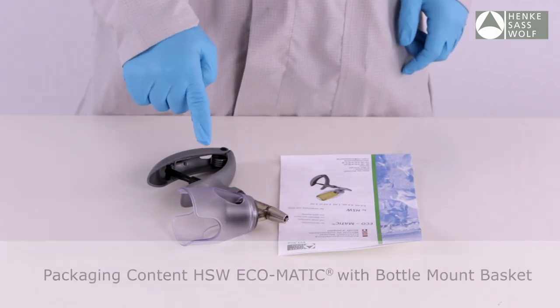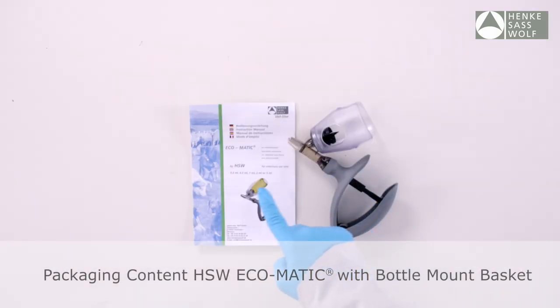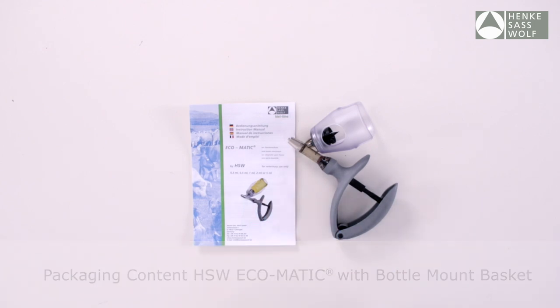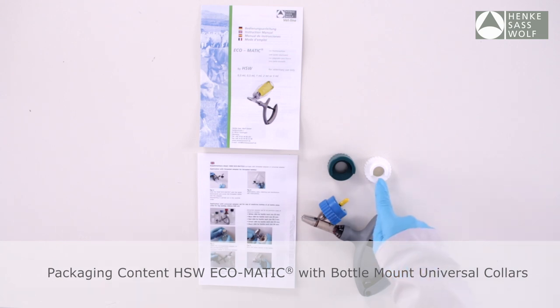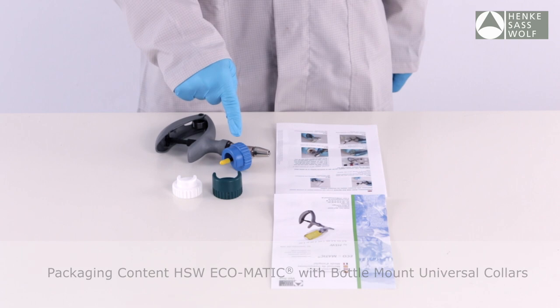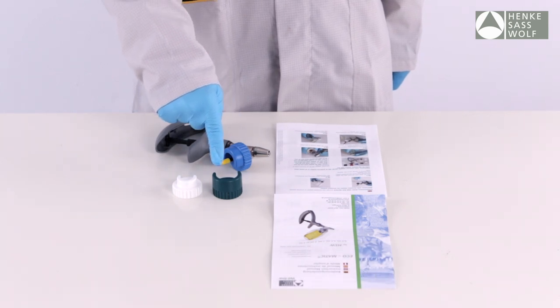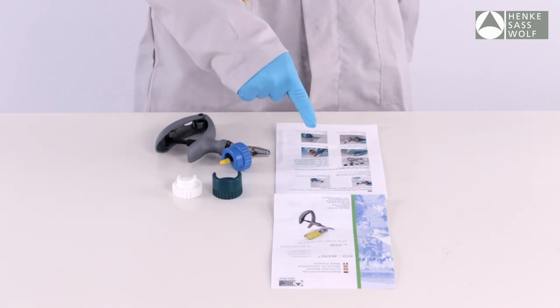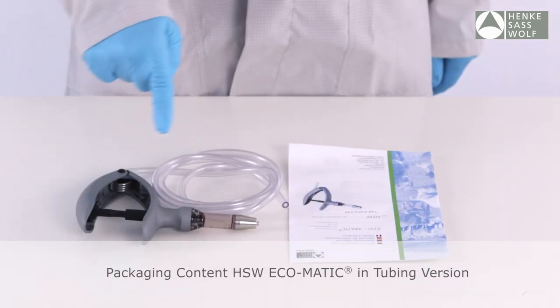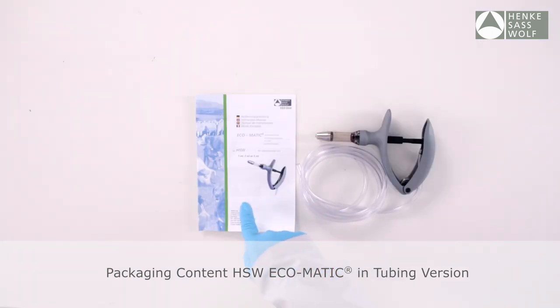Ecomatic with bottle mount. Instructions for use. Ecomatic with bottle mount: white bottle collar for bottles with 20mm, blue bottle collars for bottles with 30mm, green bottle collars for bottles with 33mm. Instructions for use. Ecomatic with tubing. Instructions for use.